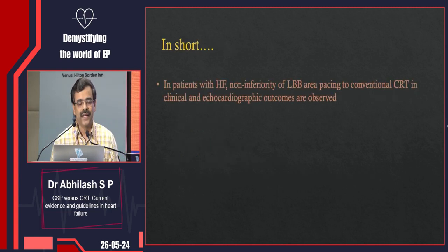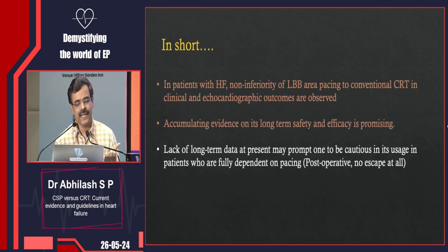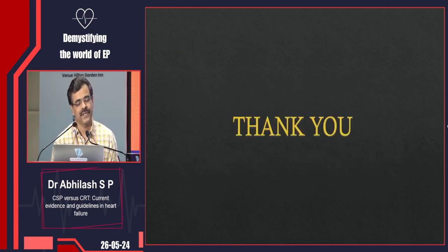In short, in patients with heart failure, non-inferiority of left bundle area pacing to conventional CRT in clinical and echocardiographic outcomes is observed. Accumulating evidence for long-term safety and efficacy is promising, but further safety data is still needed. Post-operative patients with no escape rhythm may still be treated better with CRT because you have one more pacing lead to support. Thank you.